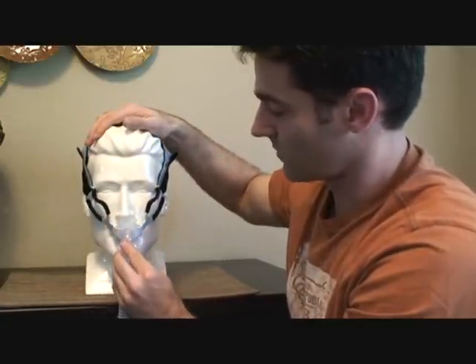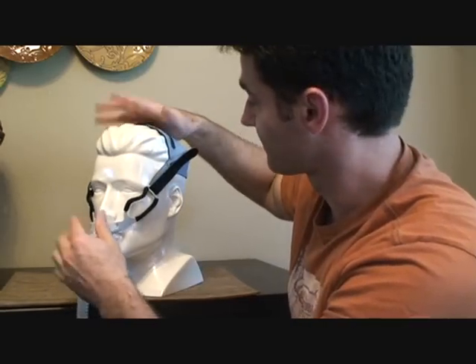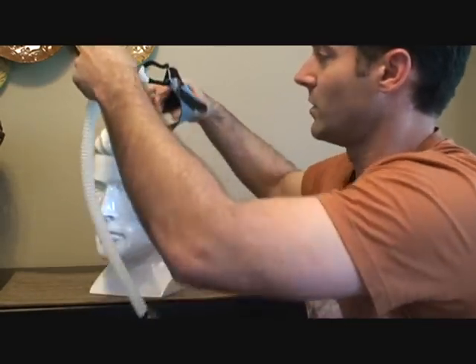You can't really adjust the angle of this mask at all — this way or that way, you just can't do it. To get it off, you pull this down, and up and over.